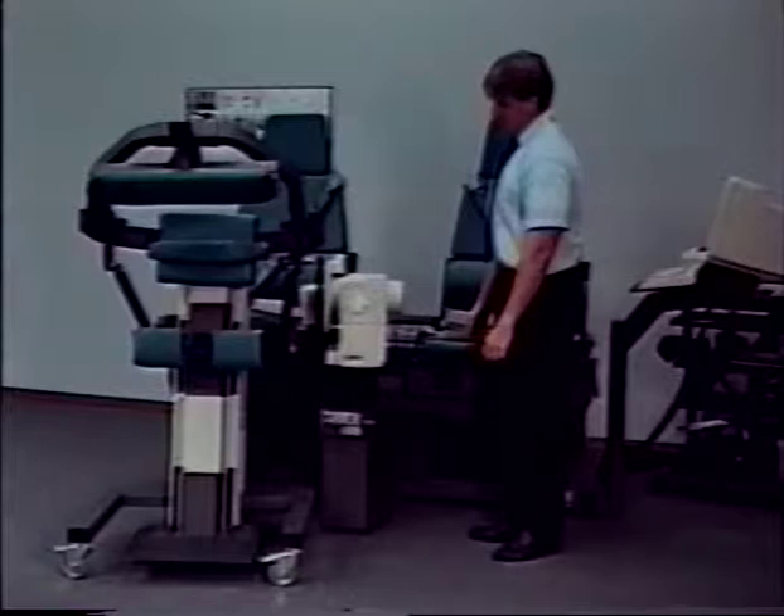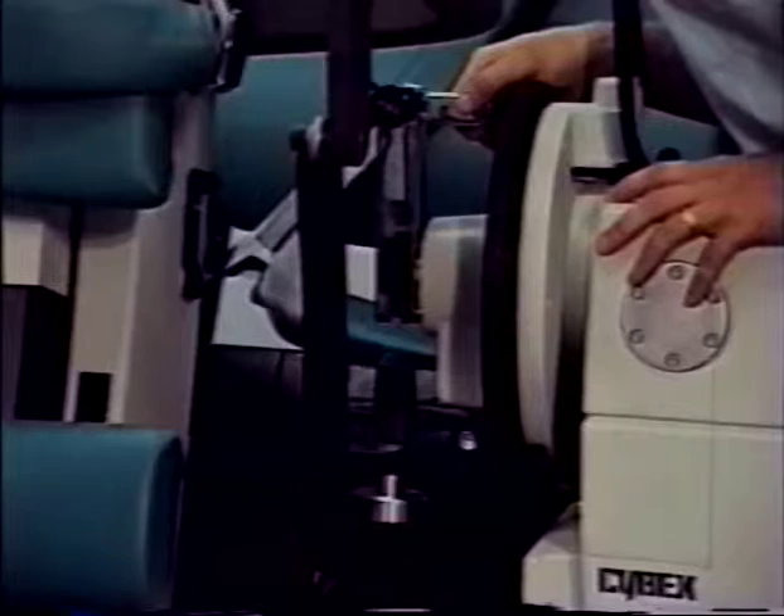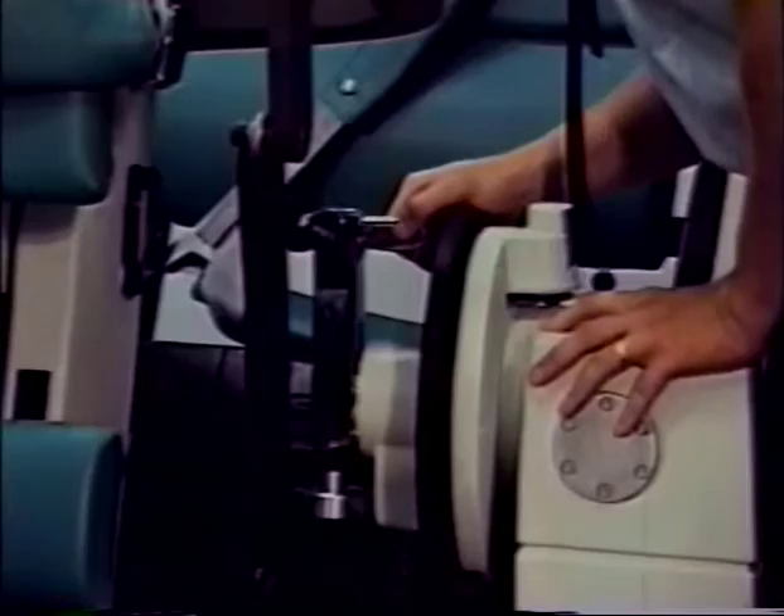Hold the dynamometer input arm in its position and set the dynamometer speed to 30 degrees per second. While holding the input arm vertically, push down on the dynamometer. The TEF modular component docking adapter should slide into the dynamometer input arm.